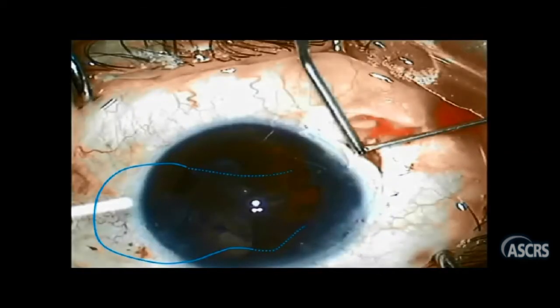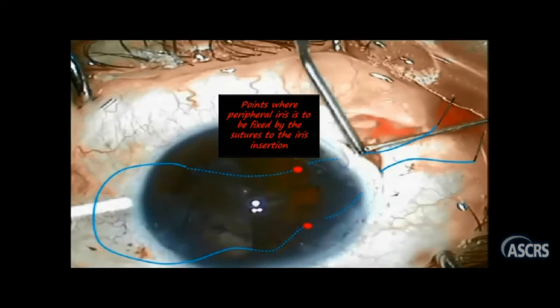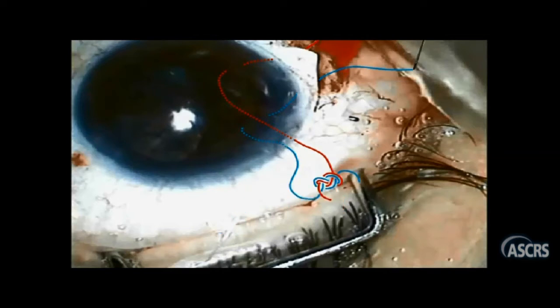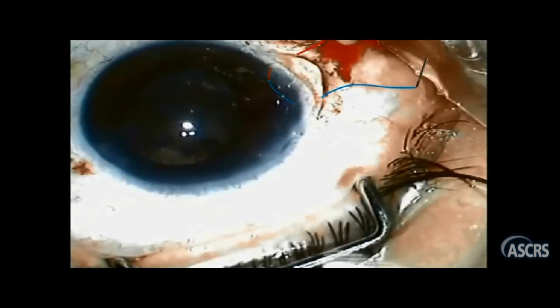The idea is simply to introduce the two needles of the prolene suture through the cornea, passing them through each end of the iris periphery at the dialysis area, and retrieving them from beneath the scleral flap. Pulling a loop of each of the two sutures through the main wound, cutting them to get four ends, tying the two inner ends together, and finally pulling the two outer ends from beneath the scleral flap and tying them together, pulling the iris back to its root.